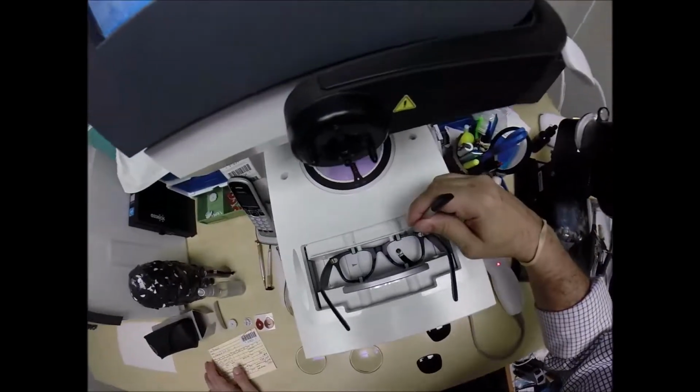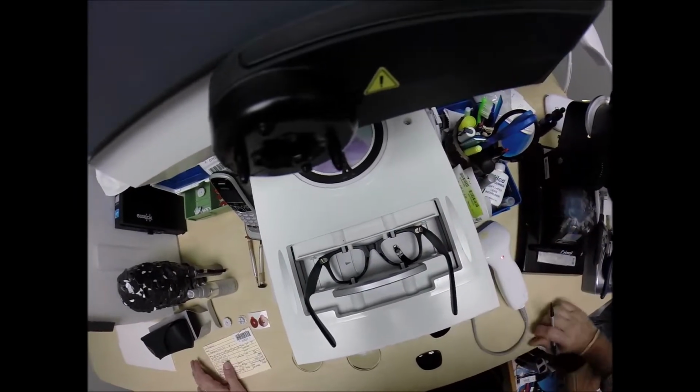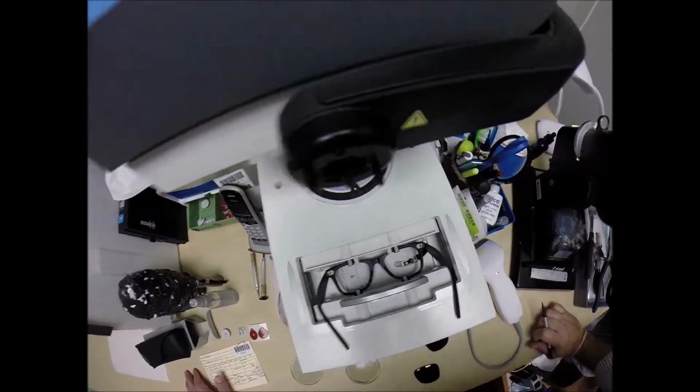I'm going to hit the start button. A little stylus is going to pop up and go around and trace the inside bevel of the right side of the frame before doing the same thing on the left.